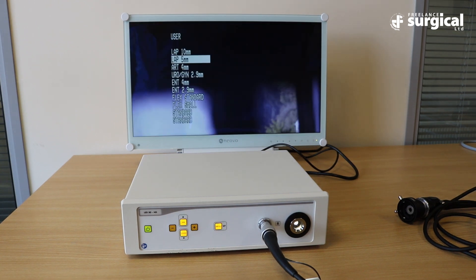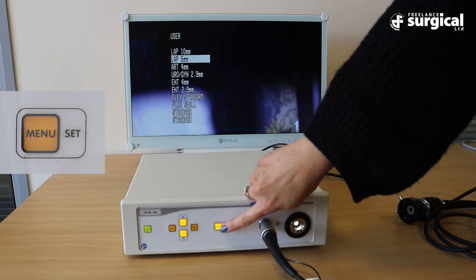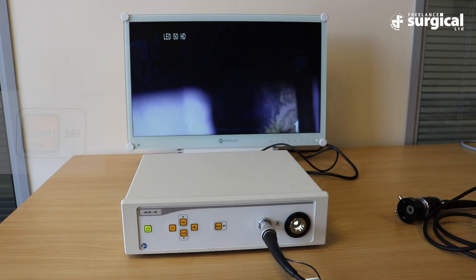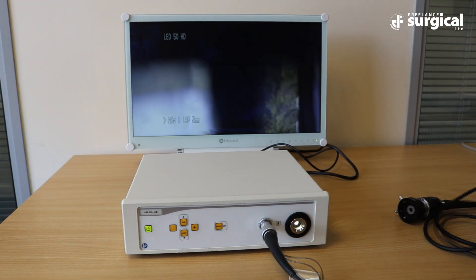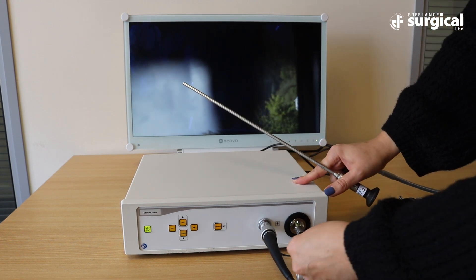You will now be presented with options on the monitor. You will need to select the lap 5mm option. With this option highlighted, press the menu set button. You now need to plug your light source into the unit and connect to the camera as shown.